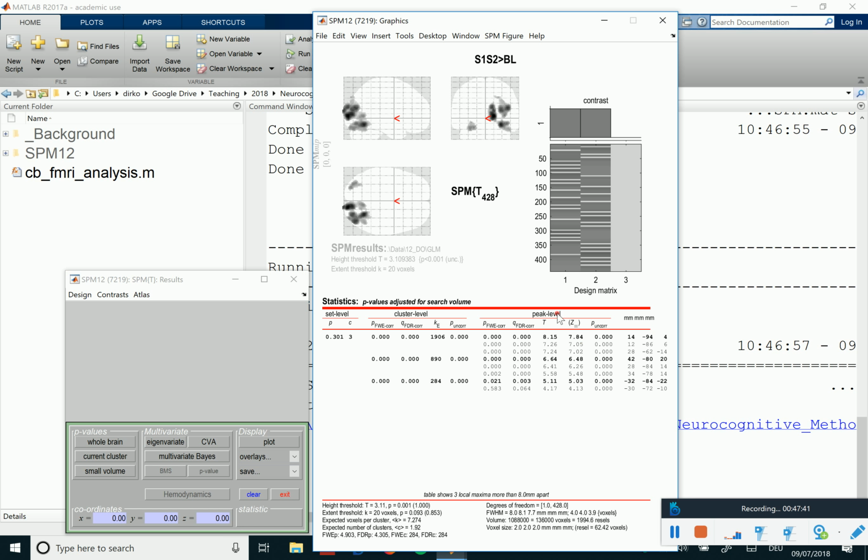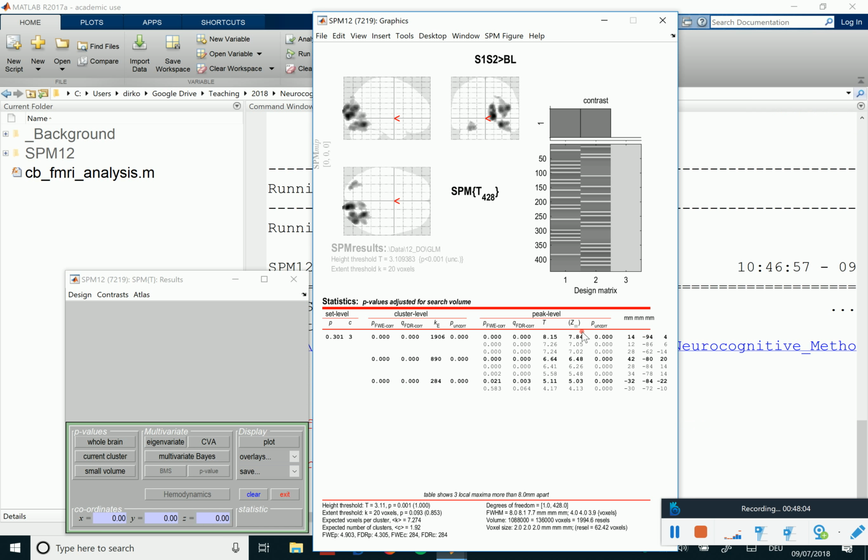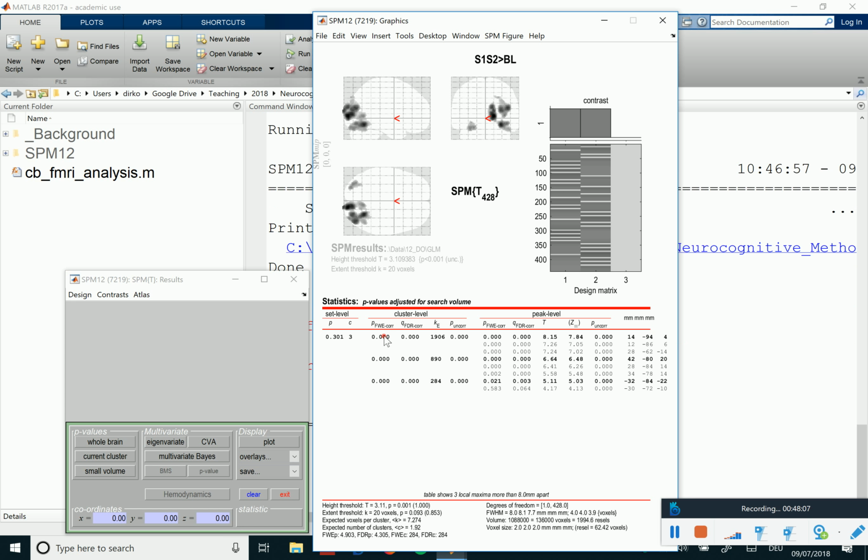So now this just ran again and shows that indeed it can be automatized, that the whole thing ends on this. And then it's over. Then you do a multiple testing procedure by deciding that you report this because it's significant, as we discussed this morning. It's over. There is no more to do.